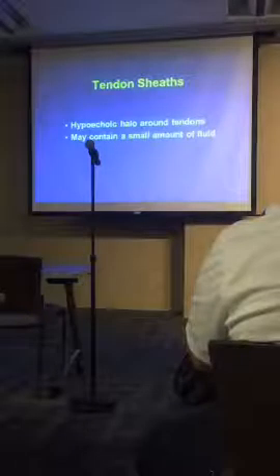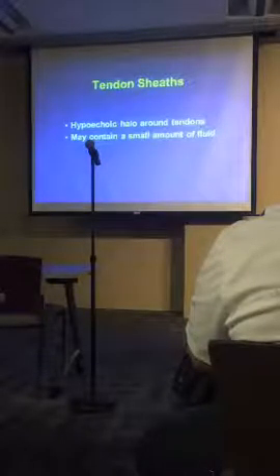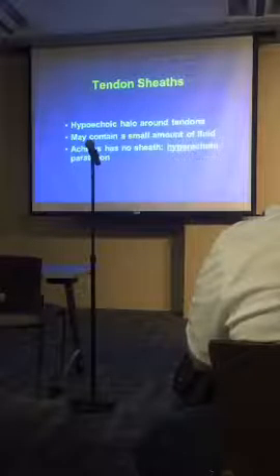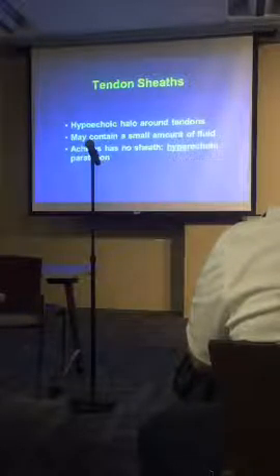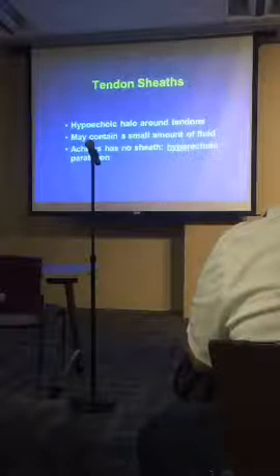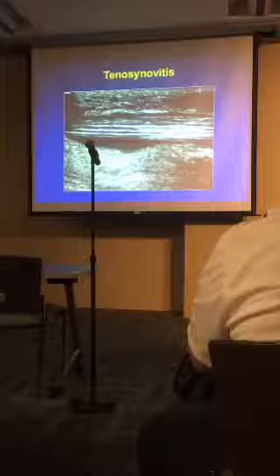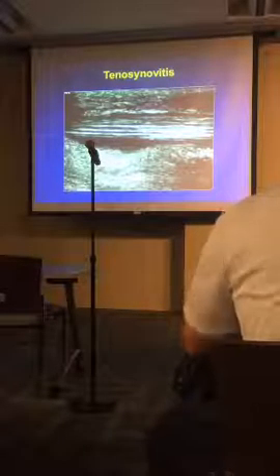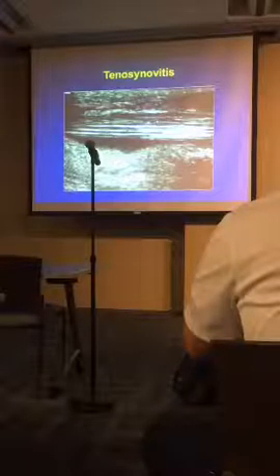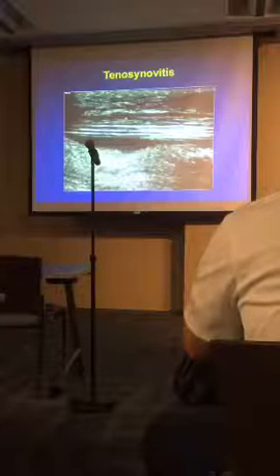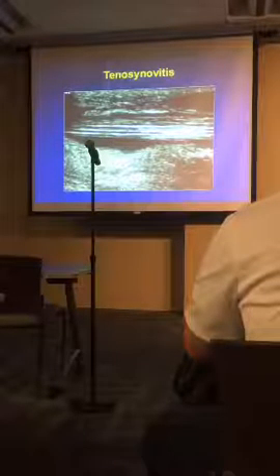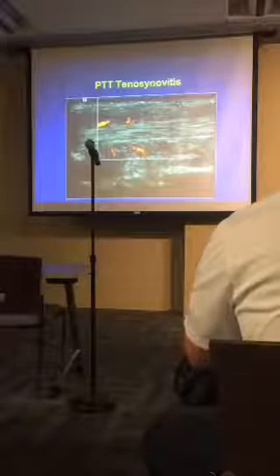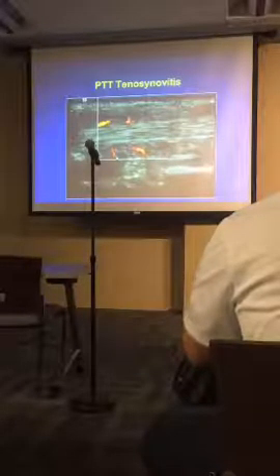Moving to tendon sheaths: these are hypoechoic halos around certain tendons that may contain a small amount of fluid, and their role is to lubricate tendon motion. The Achilles is an important exception — it doesn't have a hypoechoic sheath; it has a hyperechoic paratenon with no true sheath. When a sheath becomes inflamed, we call it tenosynovitis. In the posterior tibial tendon at the ankle, the main abnormality is dark hypoechoic fluid surrounding the tendon; with Doppler, most flow is in the sheath around the tendon rather than within it.